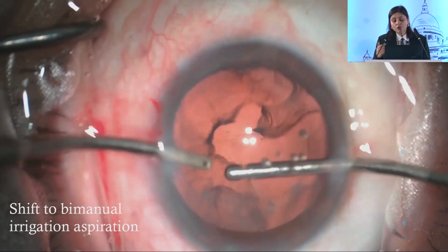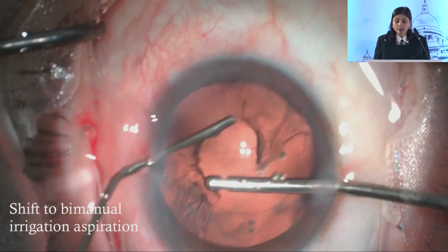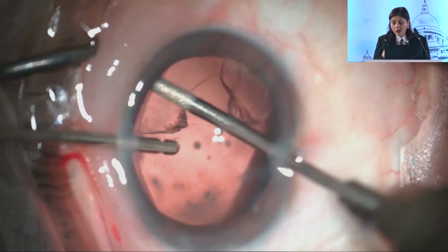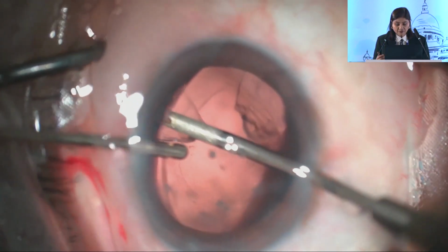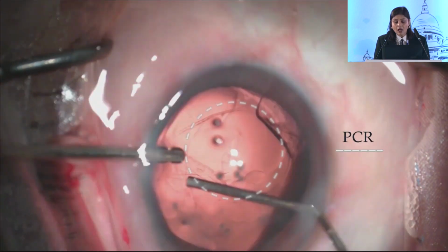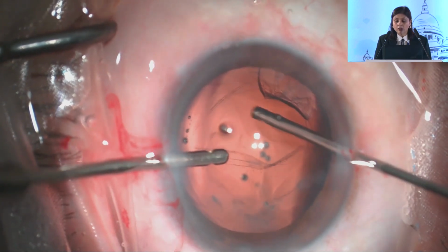So once we have ensured that we are not pulling on the vitreous and there is no vitreous in the anterior chamber, we can shift back to our bimanual, or if coaxial, whatever works well in your hands, irrigation aspiration cannula. And after removing this, this is the extent of PCR which is now visualized. We can see there's a significant degree of capsular dehiscence.